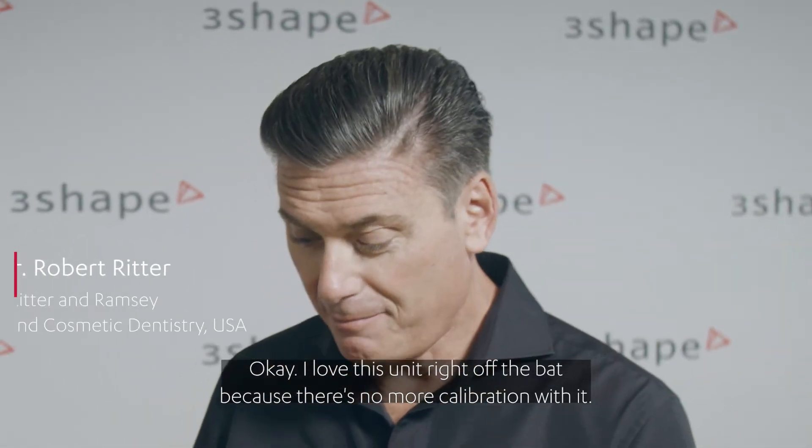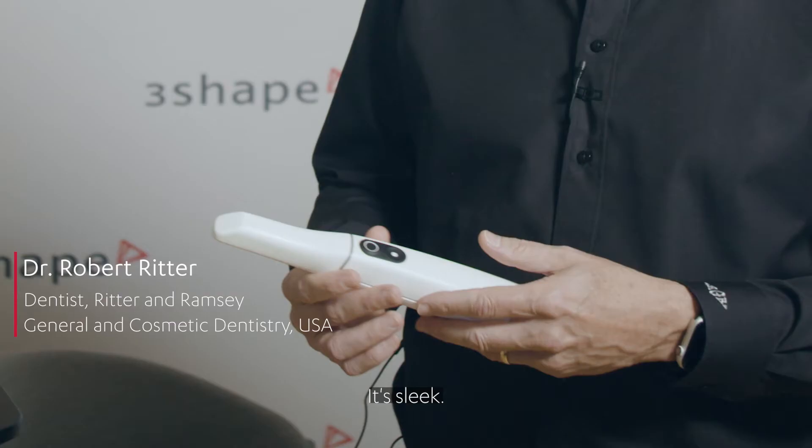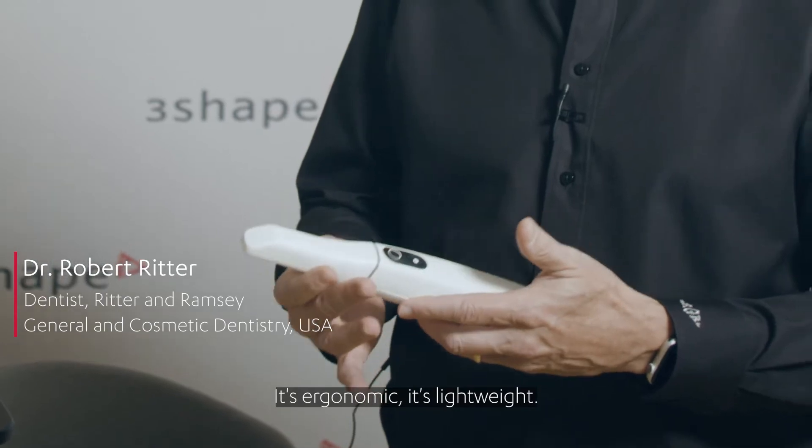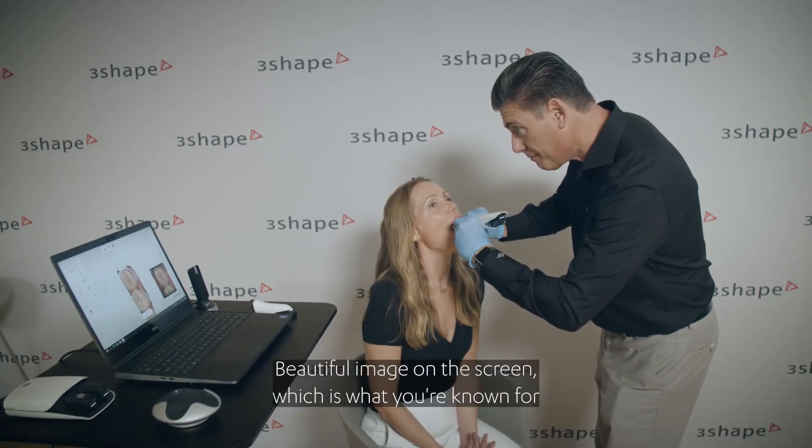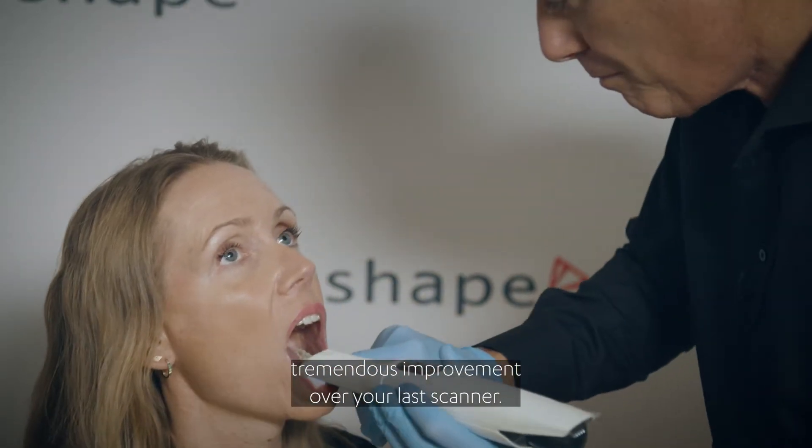I love this unit right off the bat because there's no more calibration with it. It's sleek, it's ergonomic, it's lightweight, it scans quickly, beautiful image on the screen which is what you're known for. Tremendous improvement over your last scanner.